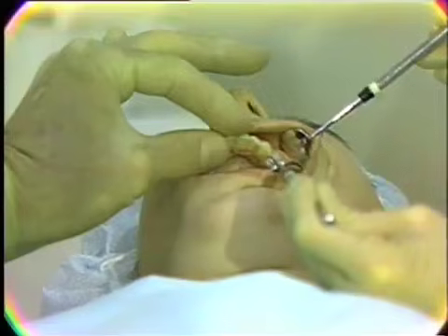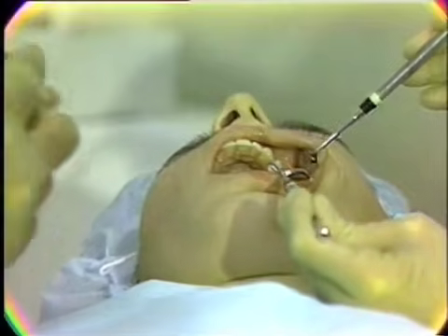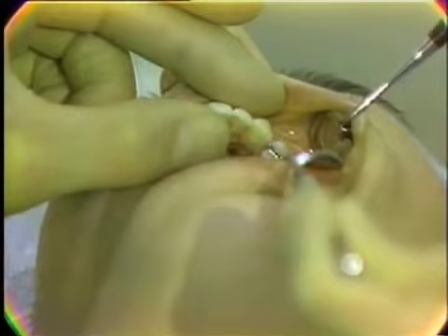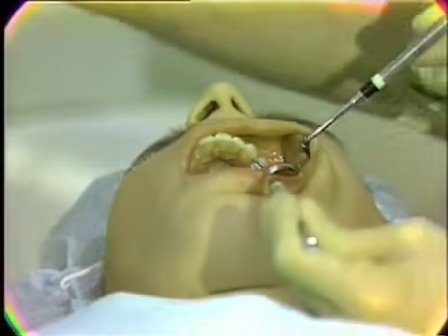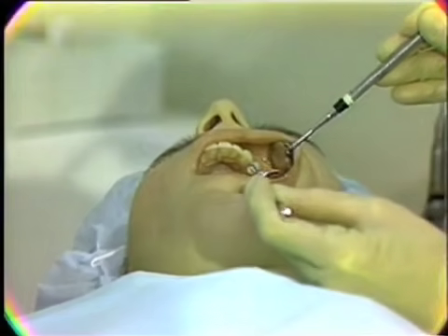In the approach to this region, we could apply instruments in the same manner that we did in the mandibular arch. This is a curette applied to the buccal and to the palatal gingival margins. We could apply all of the other instruments in the same manner we demonstrated in the mandibular arch.